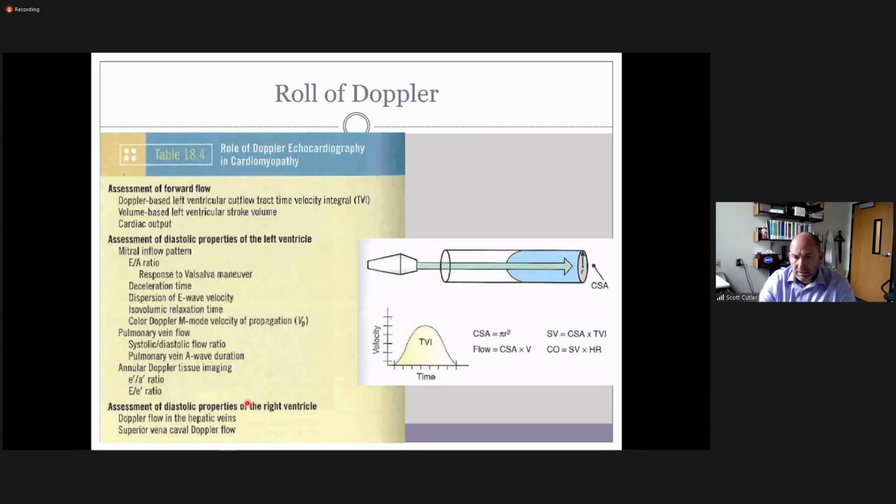Again, we're looking at diastolic functions. So anytime we've got systolic dysfunction, we also likely have diastolic dysfunction. So if our chamber again is very dilated, it's not all systolic problems. There's often some diastolic stuff. And as we know, diastology is all Doppler essentially. So again, remind me for diastolic function, what Dopplers are we looking at?